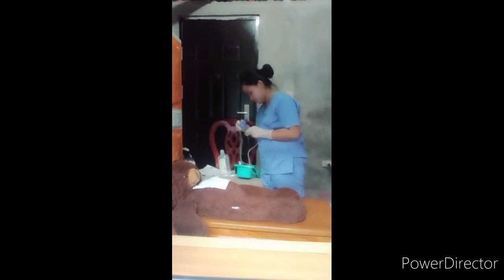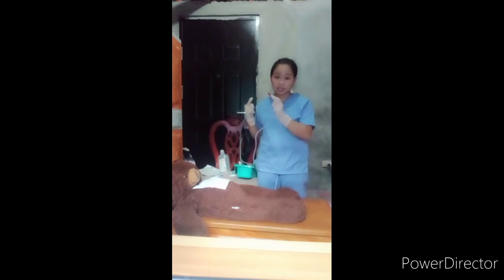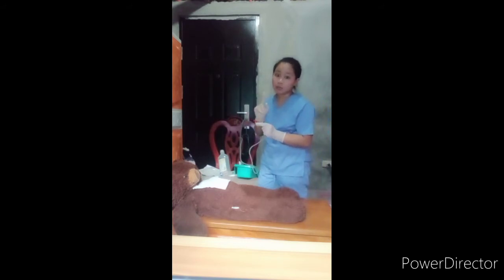Okay. And then next, let's coat the distal end of the catheter with lubricant. And then next, let's remove the oxygen delivery device if applicable and insert the catheter into the nose without applying suction, instructing the patient to breathe deeply. And then next, for nasopharyngeal suctioning, let's insert the catheter properly through the nares and advance to the back of the pharynx, do not force. And let's perform intermittent suction with a rotating catheter while rolling it between the fingers.